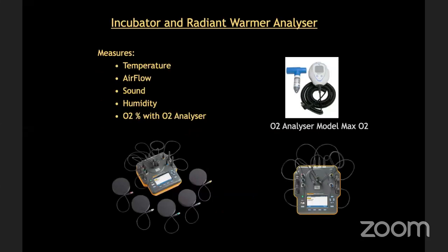These measure what is inside the incubator, like what is the temperature inside the incubator, whether the airflow is there or not, what is the sound level inside, what is the humidity inside, what is the percentage of oxygen inside, because it is a closed envelope. So you have to measure. This test equipment is like a baby.